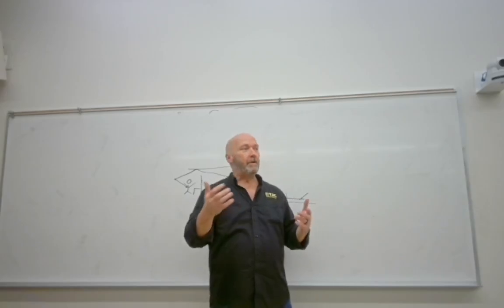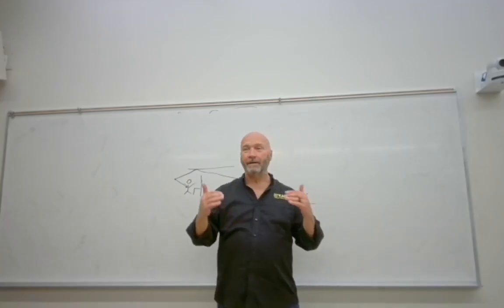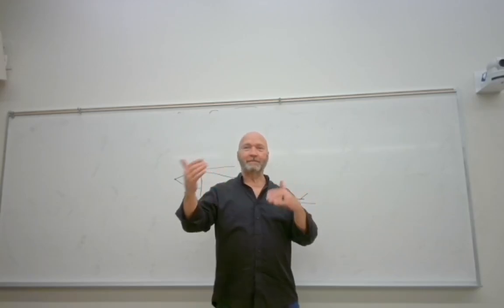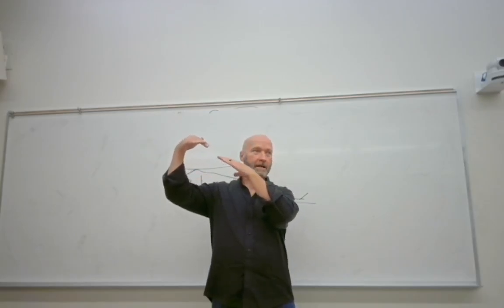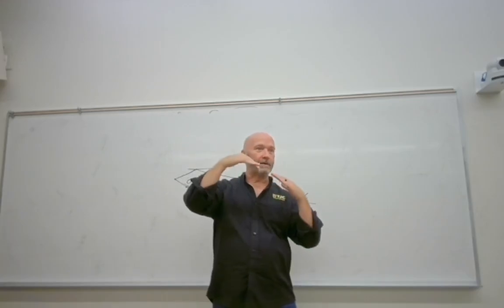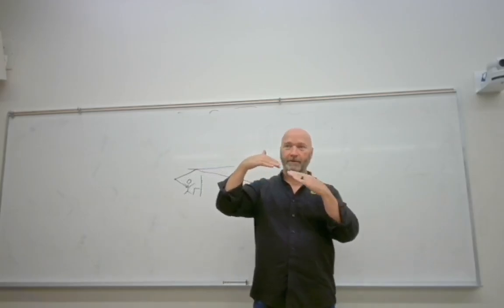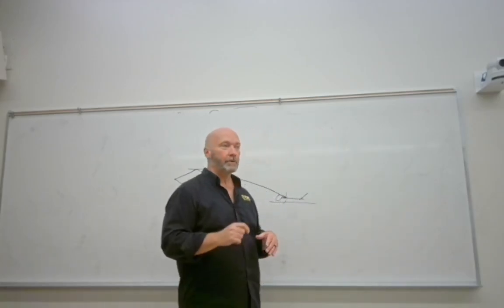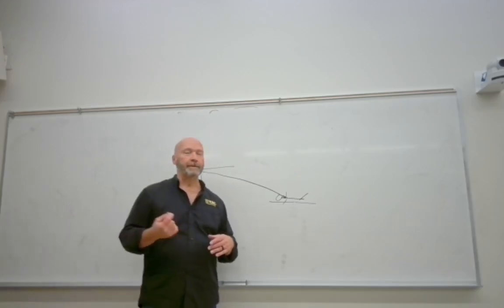Okay? So now imagine you've got a floating tabletop with those solenoids that might not hold the table completely still. You got this patient on the tabletop, and they're not strapped into the boots, and the tabletop starts sliding. Is it going to stop eventually? Yeah, it's going to go thunk, and then what's the patient going to do? You're going to be doing a skull series, right? They're going to come off of the table onto the floor. So floating tabletops are good for radiography rooms, not good for fluoroscopy.